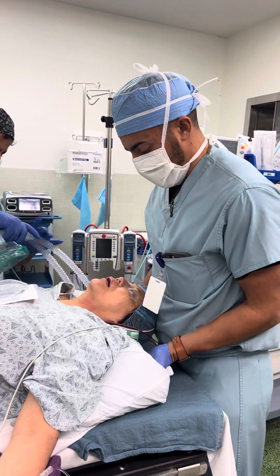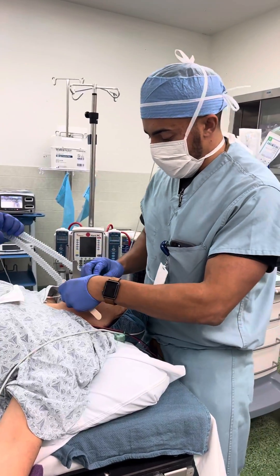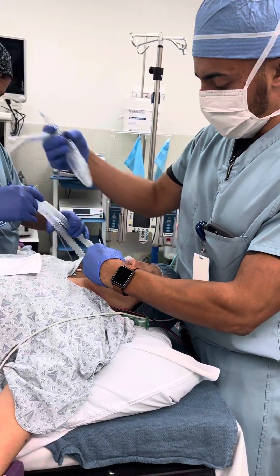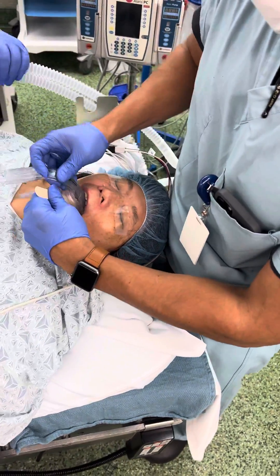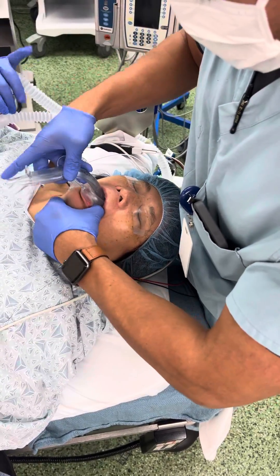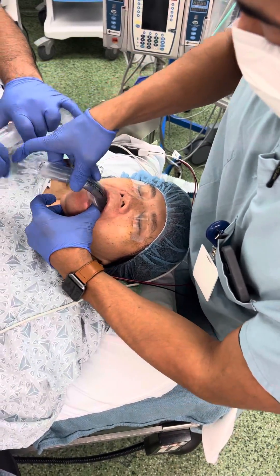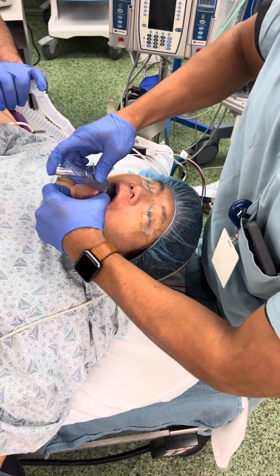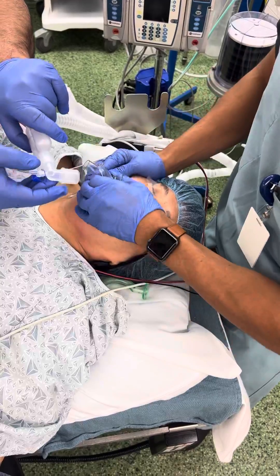I'm going to bring this in like so. I like to use a tongue blade to just kind of open up a little bit in there. This is a Supreme LMA — we'll go right in like so. I'll pull this out. I'll put my hands in here like this, pull up a little bit, and as this slides on in — there we are, perfect.